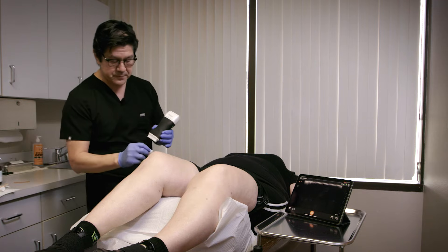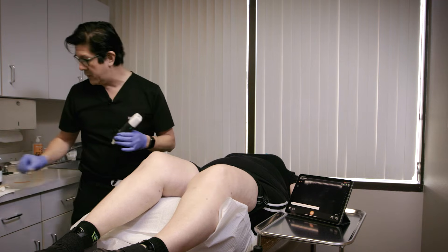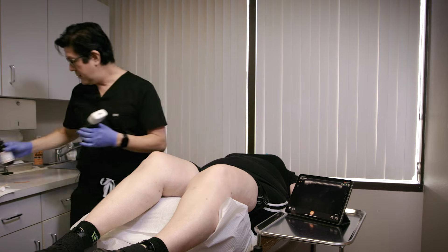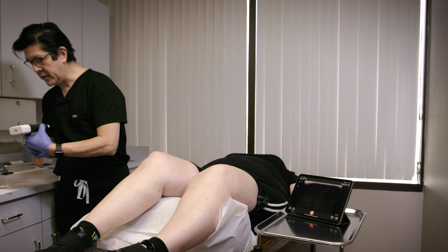So first we'll clean it up, get it prepped up and ready for the injection. I'm going to use ethyl chloride to numb up the skin, and then we'll be able to do our injection.